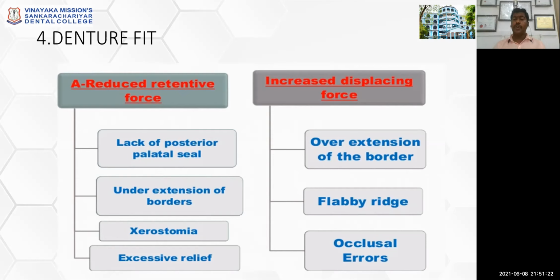So it's very imperative for you to locate the pterygoid hamulus, draw a straight line across either side of the pterygoid hamulus, and then draw the anterior vibrating line, which is Cupid's bow in shape.